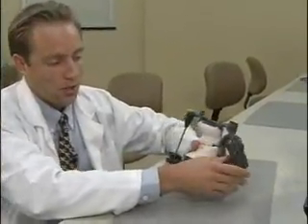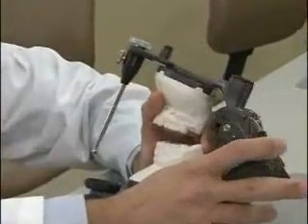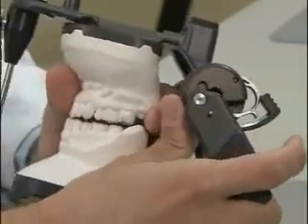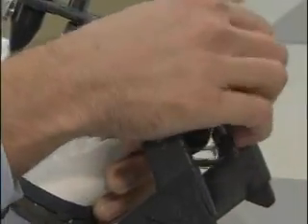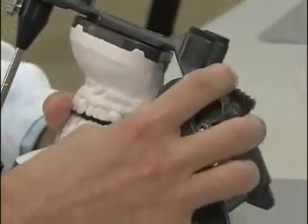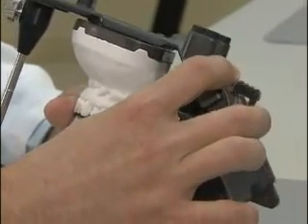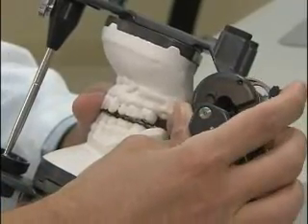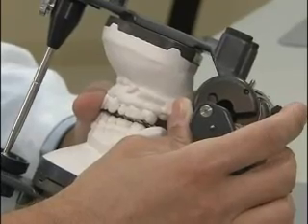Make sure your centric latch is unlocked, then take the jaw into a balancing movement. Unlock the hinge box and raise the teeth up and down to verify that what we see on the articulator is what we saw intraorally. This shouldn't be very far from your protrusive record.